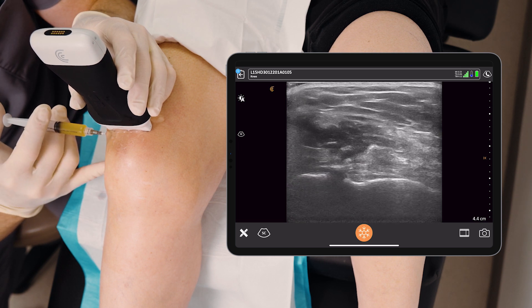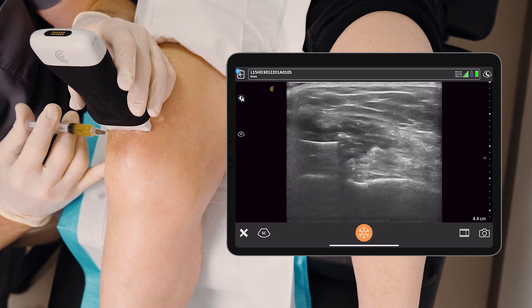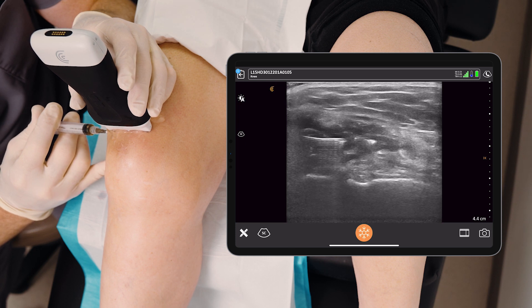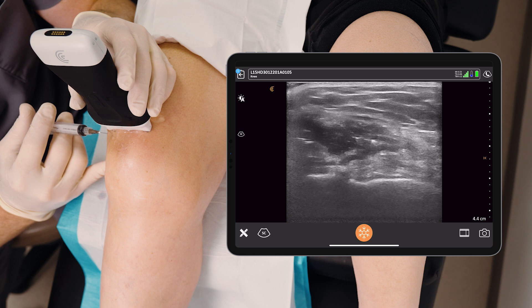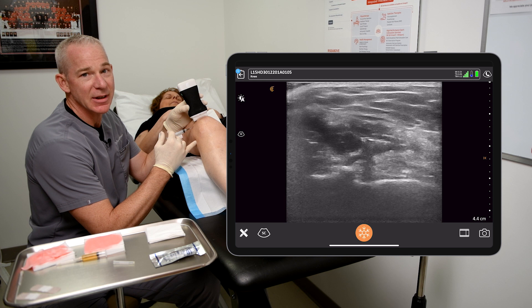I make a slight hand adjustment, brace up against the patient's skin, and inject. You can see that flowing all the way across the screen. It would be incorrect if my needle were back here. And that's the beauty of the ultrasound — I can see exactly where the needle tip is and I can see exactly where the fluid is flowing.